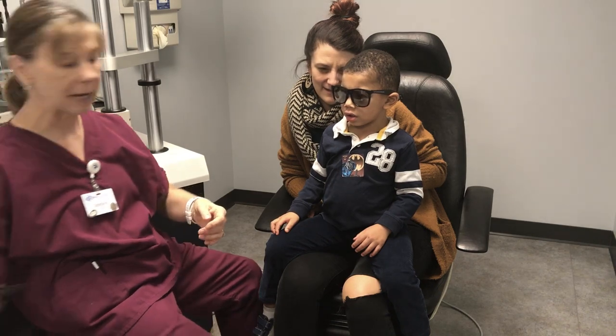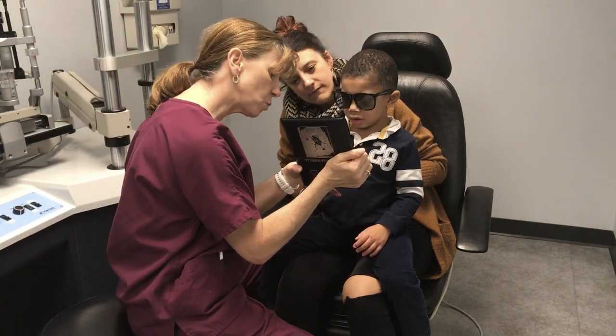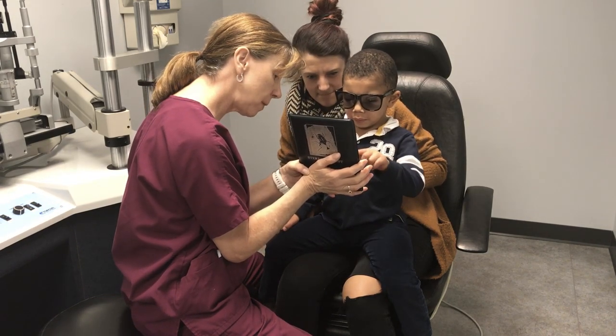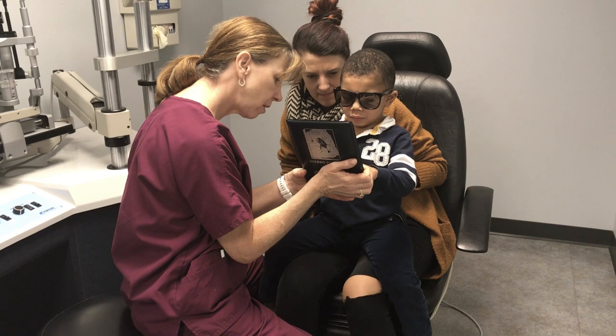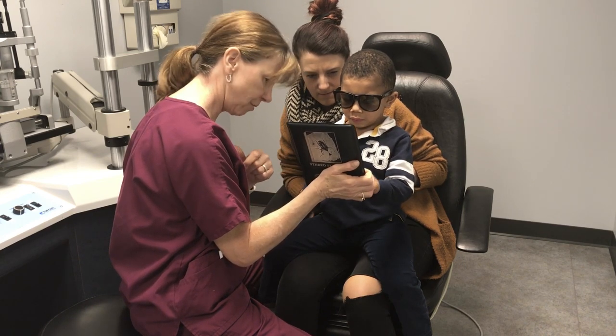Now I'm going to show you some animals. Look at these guys right here. Does one of those animals pop out of the book? Can you put your finger on the one that pops out? Very good job. Now we're going to look at another line. Look at these guys. Which one pops out there? Very good. And what about here? Which one pops out? Good job.